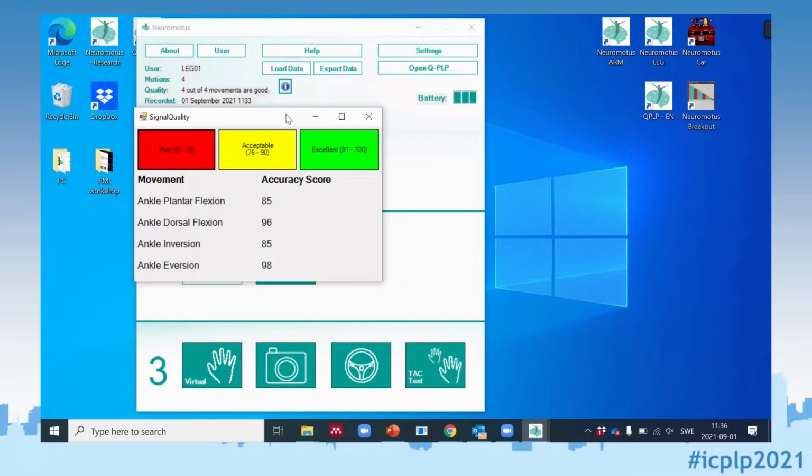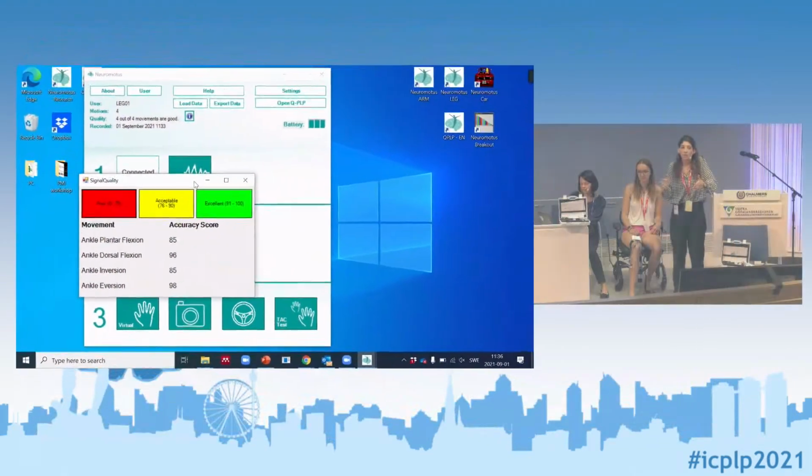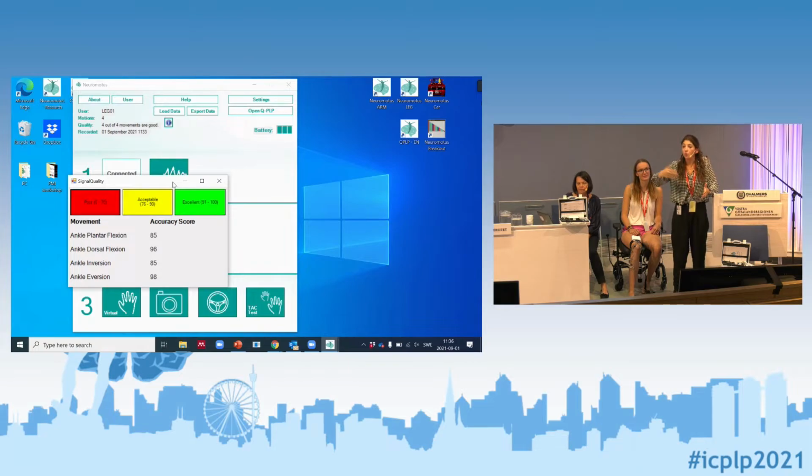So today is your first session, so it's okay. So we think, okay, we can use these signals, they're still acceptable, and we have them very good. So we can try, and if not, we do another recording session. Some patients in the beginning are not able to move forward in the treatment because it's really hard to do the recording session. But doing the recording session is still part of the training. Again, we are training how to move the phantom and to relax and to train different movements. So it's okay with that.